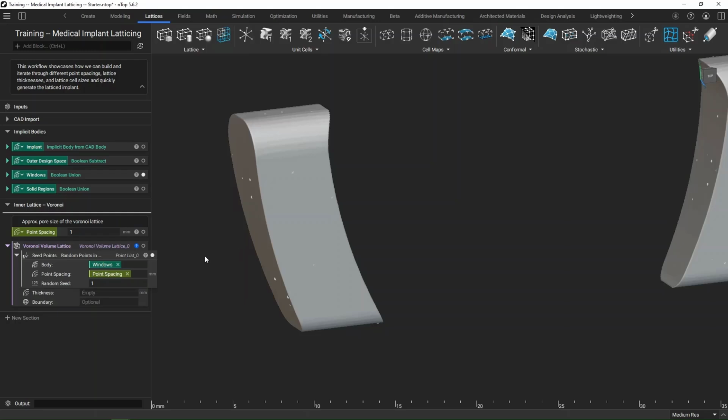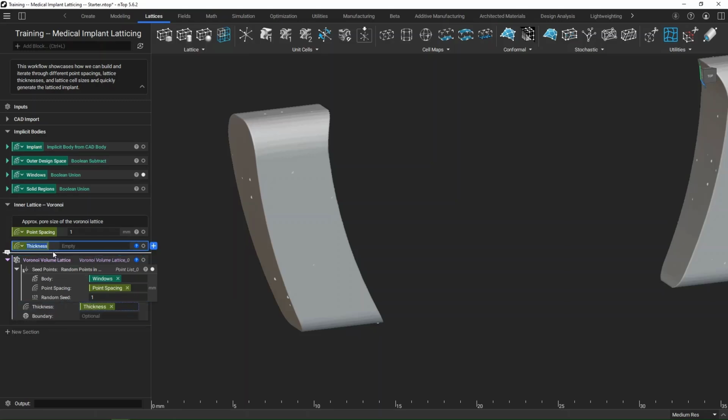We have our thickness. So that's going to be the thickness of the lattice beams. I'll go ahead right away, make that a variable. I'm going to specify that this is going to be my inner lattice thickness because I will have two different lattices that we're working with. And let's just go with, how about 0.25 millimeters? And all of this is really going to change based on your lattice size, or in your implant size as well. But this looks good to me.